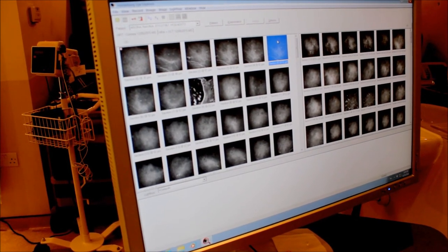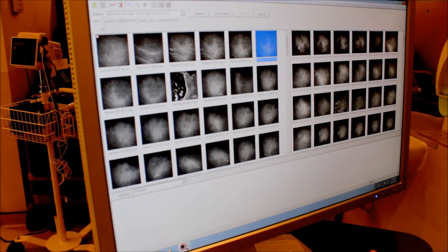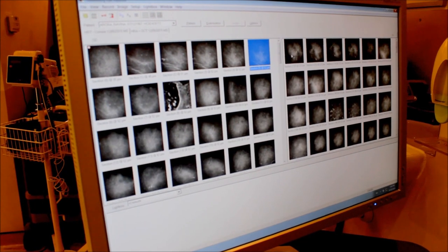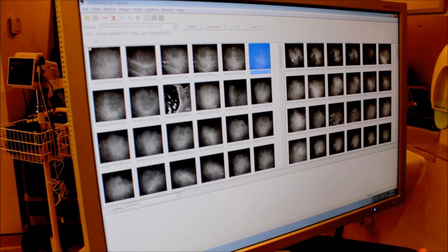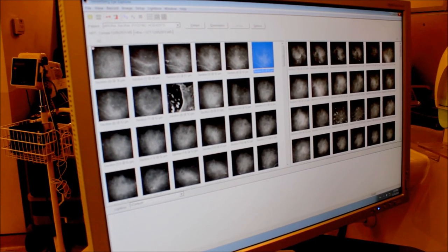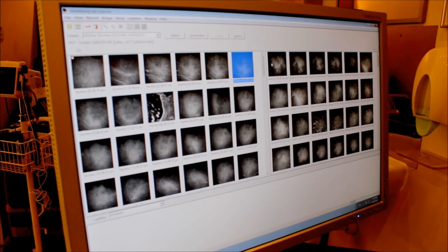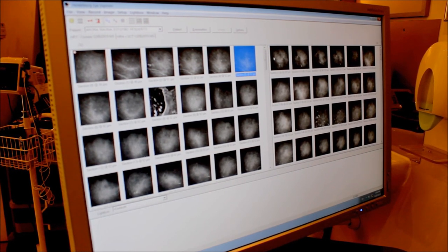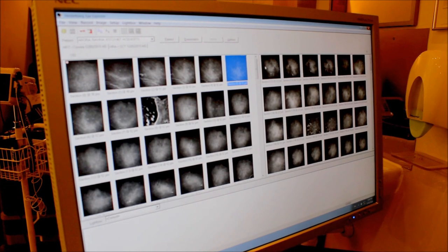So when we finish with a patient, when you examine your patient, you will usually end up with a lot of images and many of these images are repeated. As we explained in our previous presentations, what you need is about six to eight images from both eyes of a patient to have a good, true representative of the true density of the nerves in the CCM images, in the cornea of the patient.